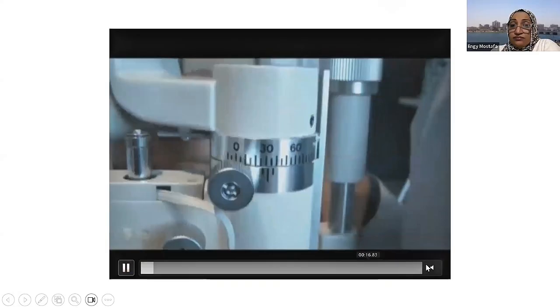One of our friends asked a question about rose bengal stain. Well, I've worked with it in some localities, but not in Egypt. The main advantage over the fluorescein dye is that it also stains the diseased areas, not only the dead or denuded areas.